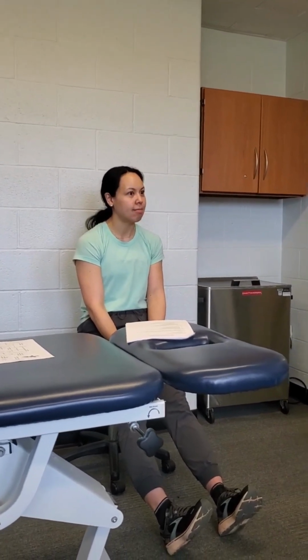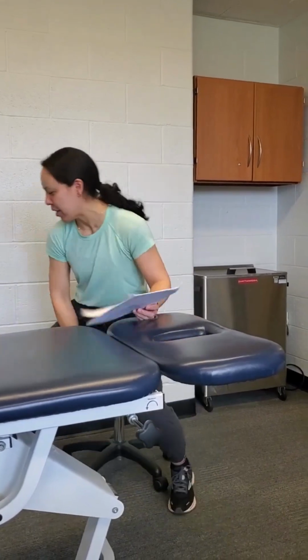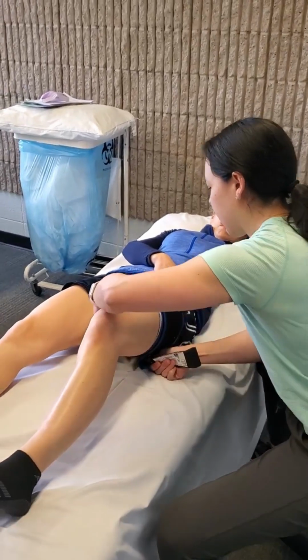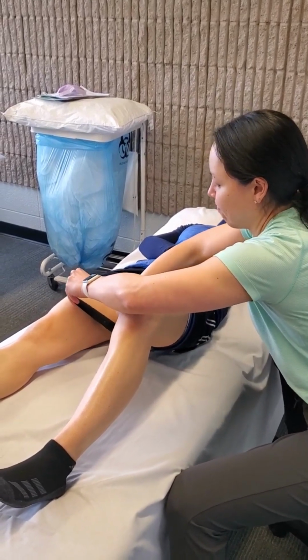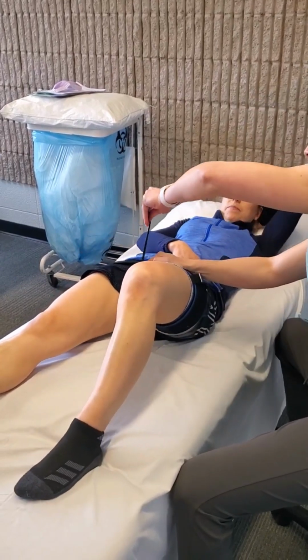All right, lab. This is the fun stuff. So who wants to go? Going as tight as you can, and then wrapping it around her like so. Yeah, bending if you want. And then I might even have to... yeah, that's good. Oh wow, that's tricky.